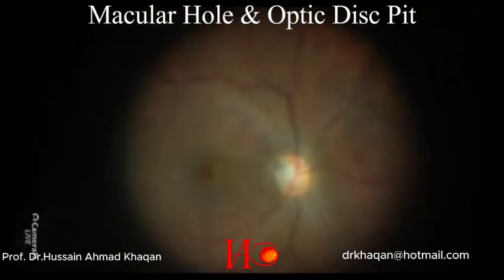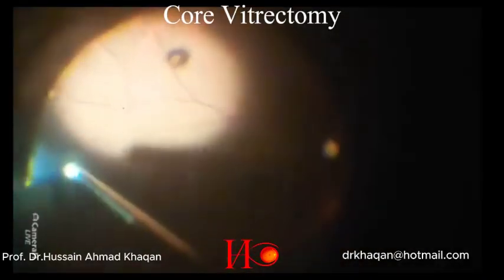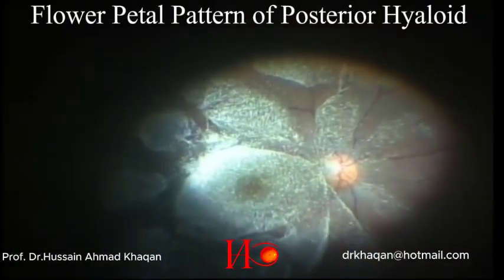Here you can see the optic disc pit and the macular hole. I am doing the core vitrectomy, and after doing the core vitrectomy, I am injecting Triamcinolone Acetonide to stain the posterior hyaloid. You can see the posterior hyaloid is stained in the shape of flower petals.